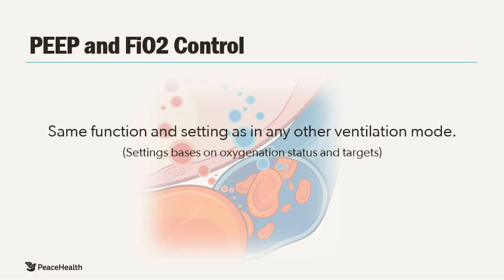As for the control of oxygenation, the PEEP and FiO2 controls function the same as in any other mode, and your settings would follow the same protocols we use at Peace Health and your own clinical judgment.